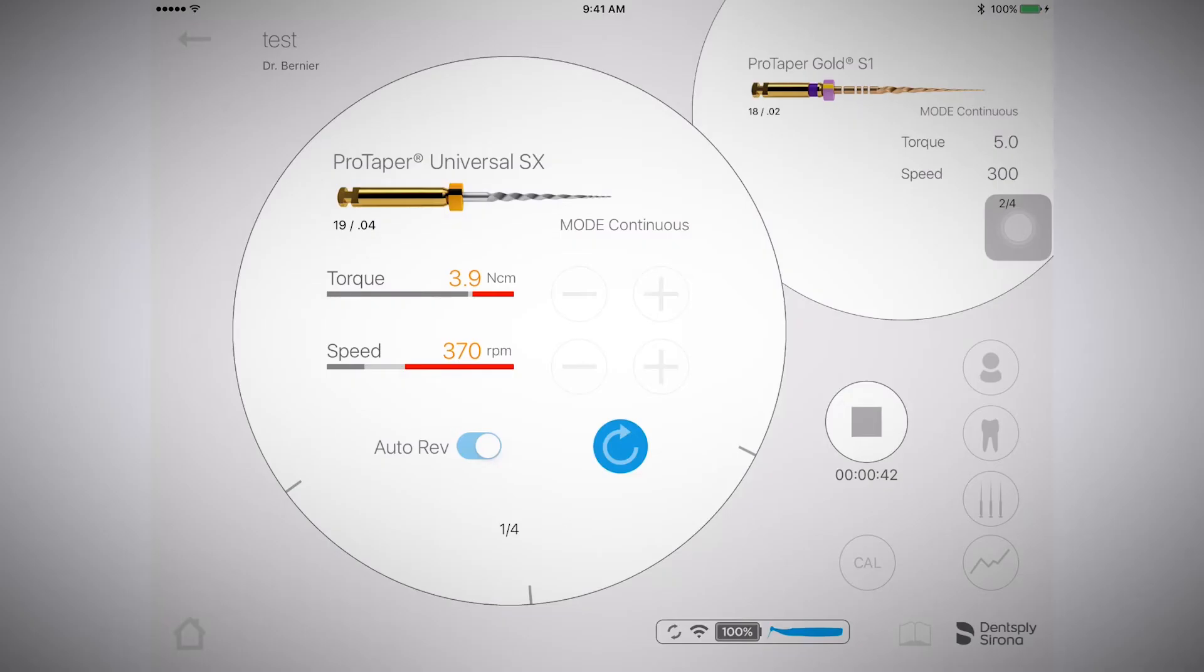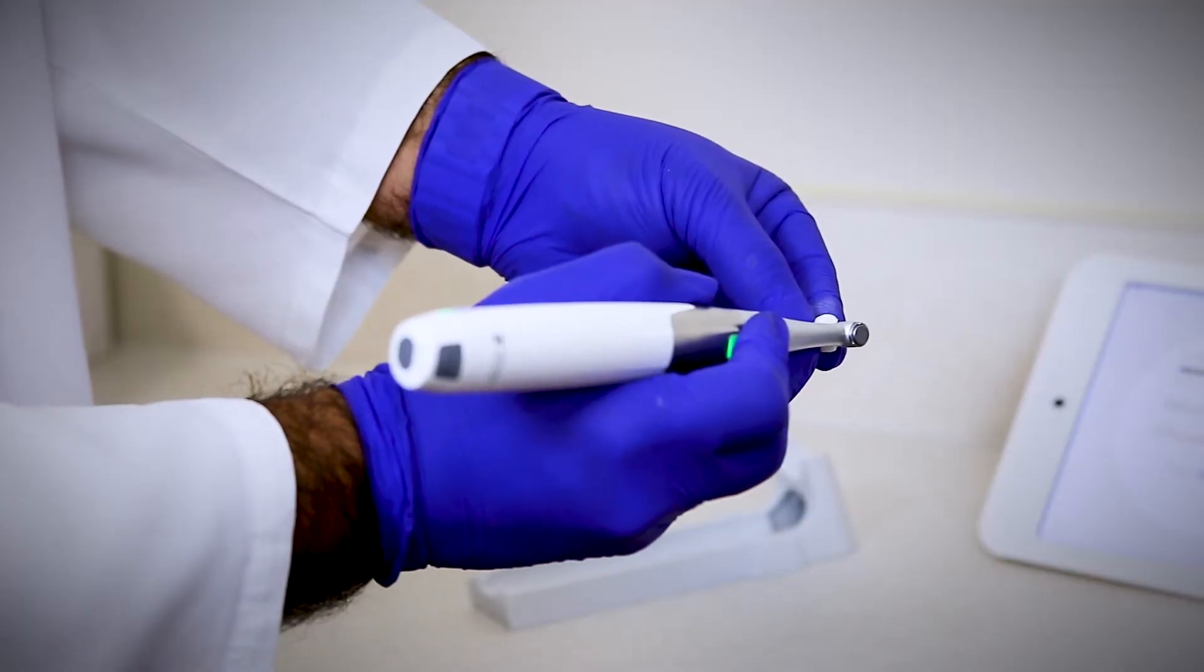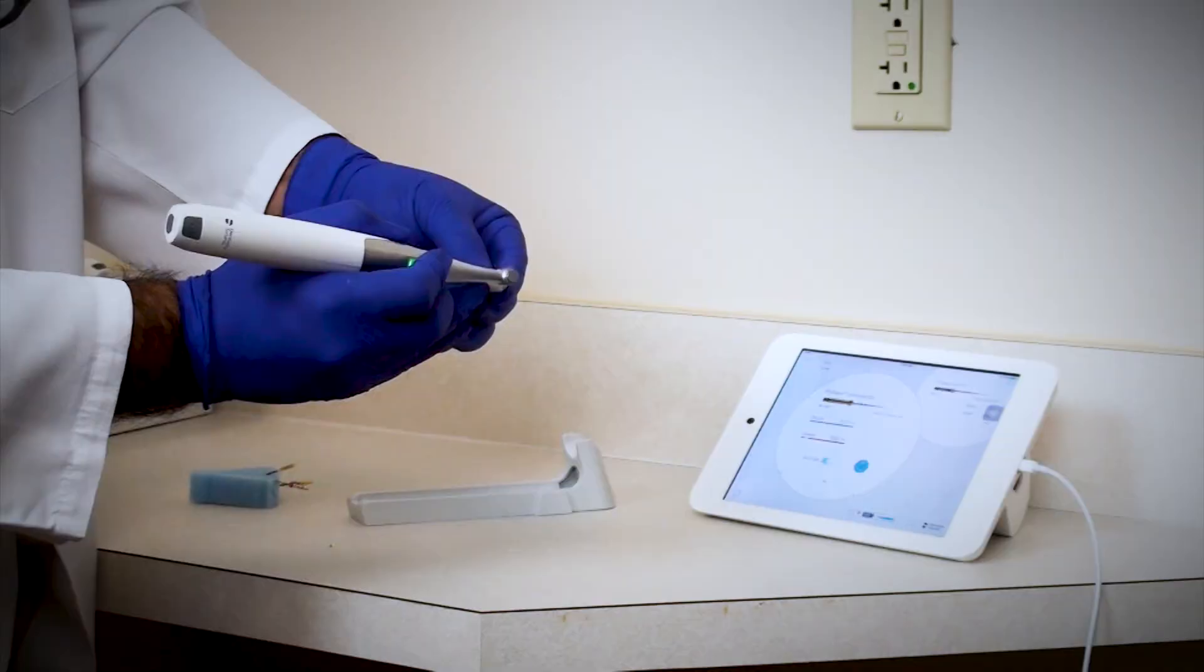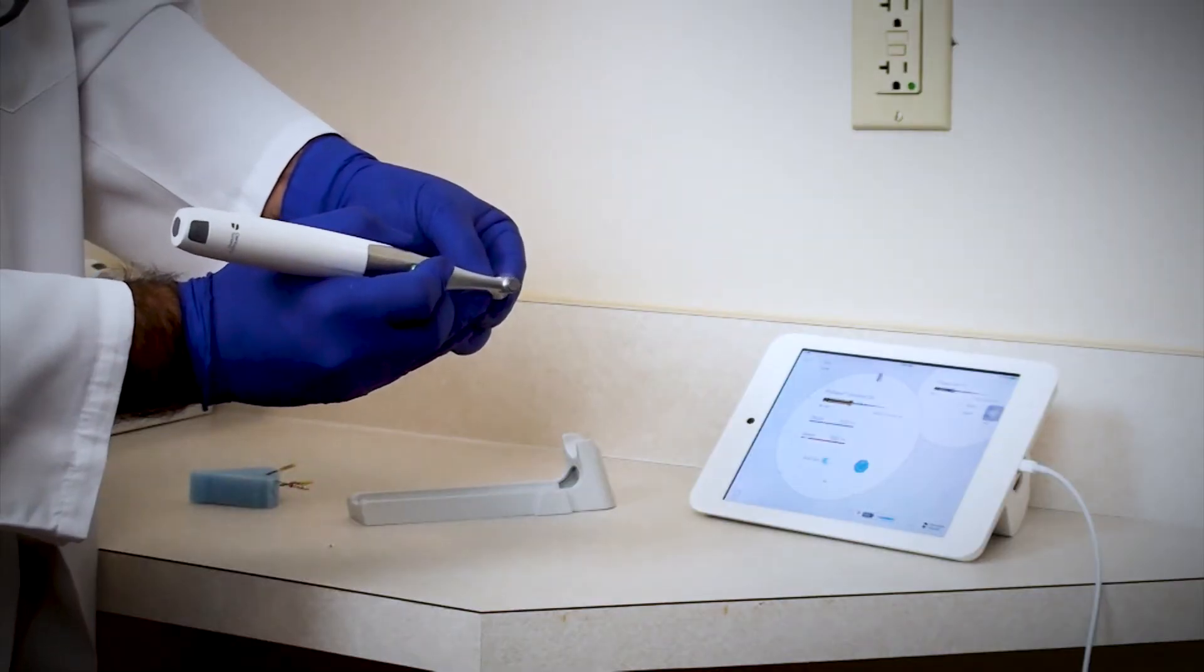With the real-time torque monitoring feature, as you apply torque, you're going to see these torque levels go across the screen. Within the start and record treatment function, it's recording all the various torque levels.